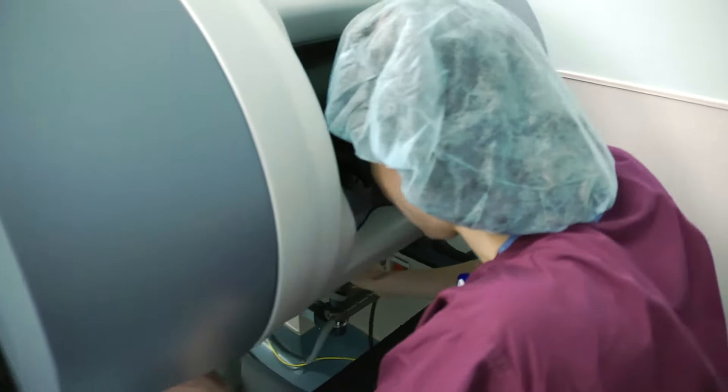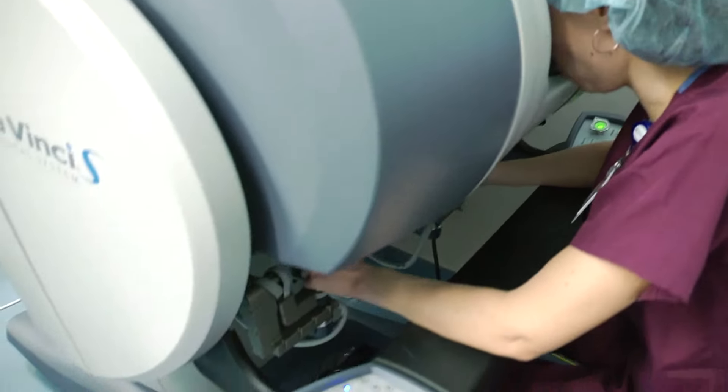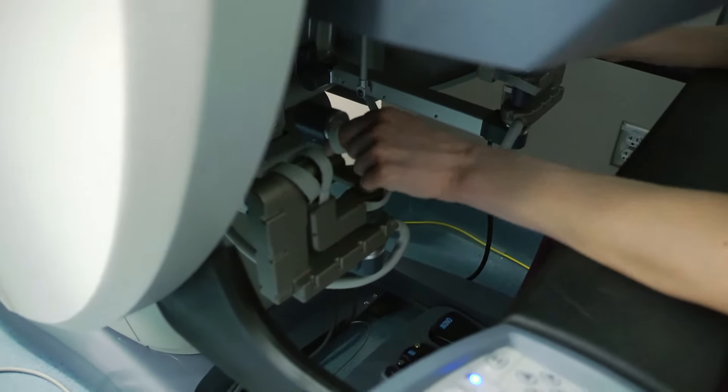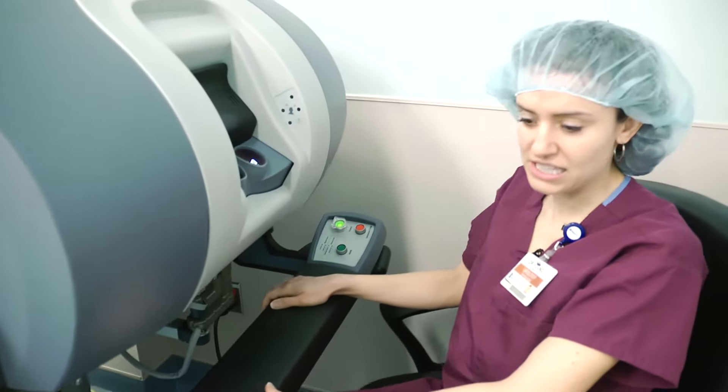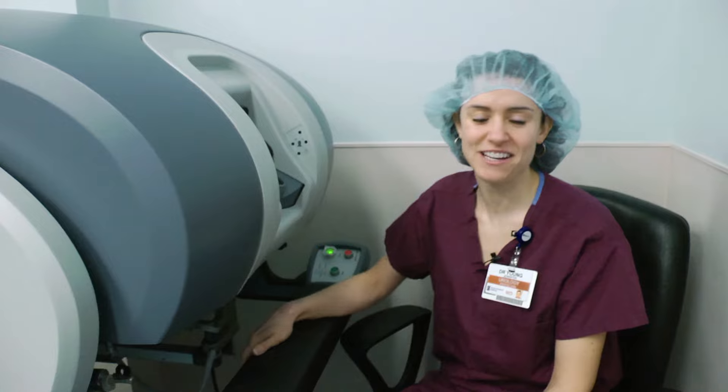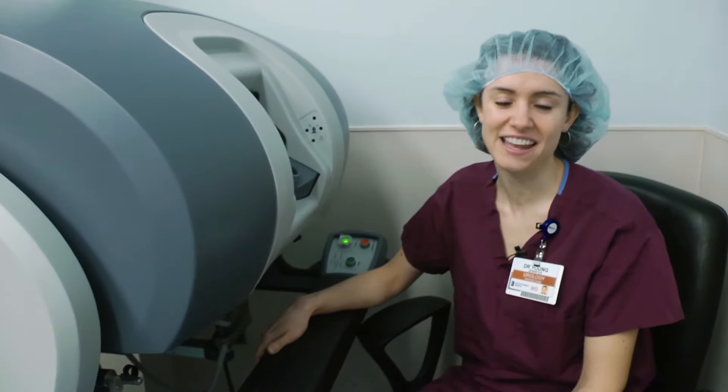When I put my head in here and move these little joysticks around, that's how the operation is completed — it's kind of like sitting in a giant video game. That's the da Vinci robot. I'm Dr. Jennifer Young with the Urology Group and Inova Loudoun Hospital.